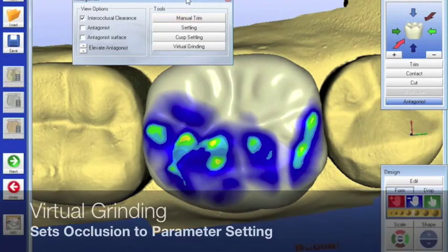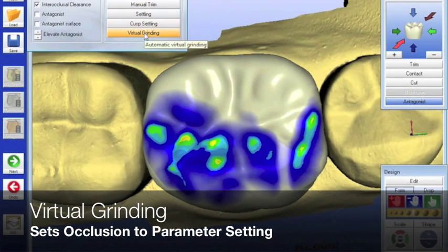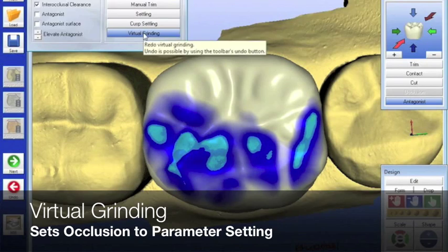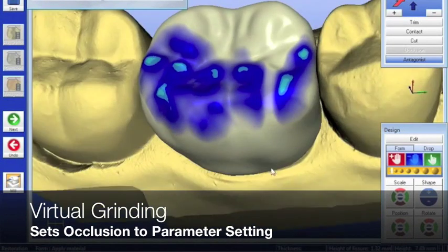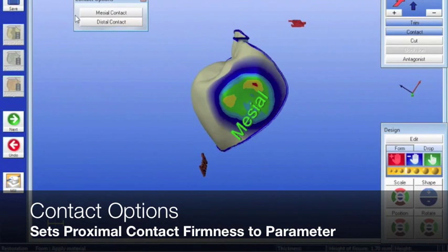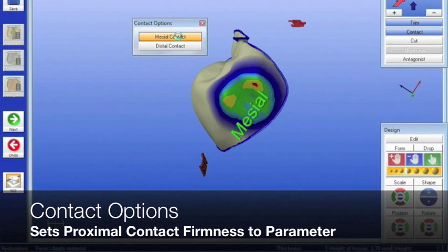The software should do most of your design. If you're having to use a lot of design tools to create restorations the way you want them, you may want to back up and think about how you prepare and how you take your optical impression. I use the virtual animated process for setting my occlusion — we call that the antagonist virtual grind — and I use the contact option to set my interproximal contact firmness based on parameters.